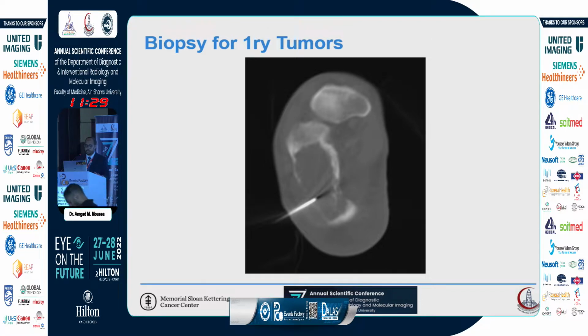These are reproducible images, so if the patient ends up getting surgery 5 years afterwards, if this turns out to be a benign lesion, they can just look at the images from the biopsy and see the approach that was used. They don't have to try to interpret the ultrasound images that you take. And this lesion ended up being an Ewing sarcoma, and she had a resection.